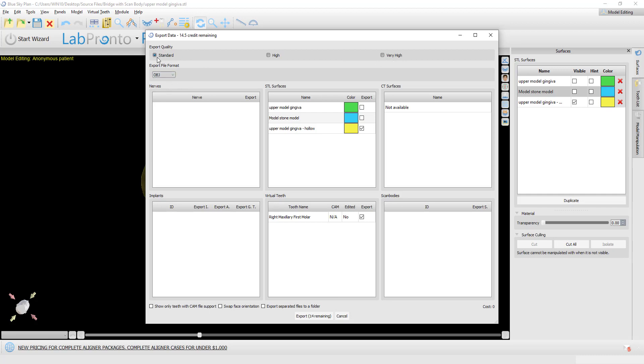You can select the quality. You could keep standard in the vast majority of cases. If you want a larger file with more detail, you could click high. But on the bottom, you want to make sure that you do not have this box checked. You do not want export separated files to a folder because you don't want separate files. You want them to be combined. So we have these items selected, the checkbox is not checked, and we click on export.